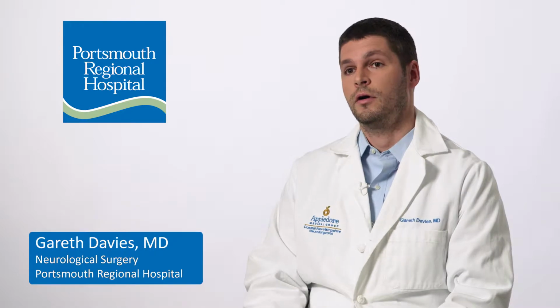So one of the advantages of deep brain stimulation is that when the device is turned off, there are no side effects, or should not be any side effects. When the device is turned on, you can see side effects, but that depends upon where the leads were placed. This is one of the major reasons that the patient is awake for the surgery when we implant the leads.